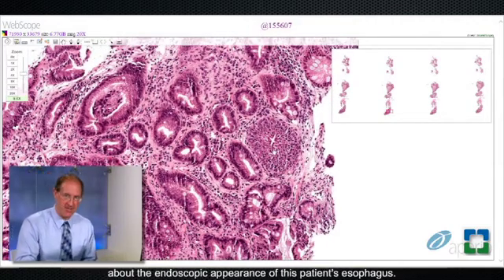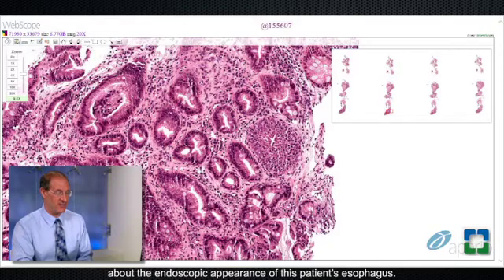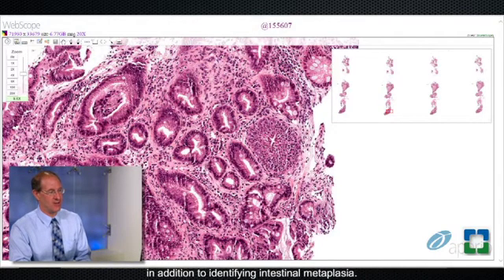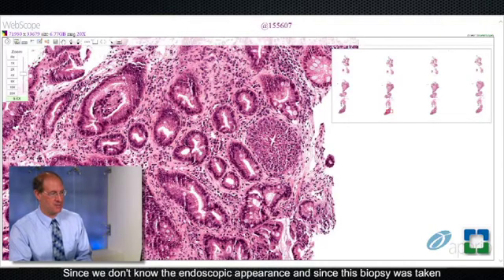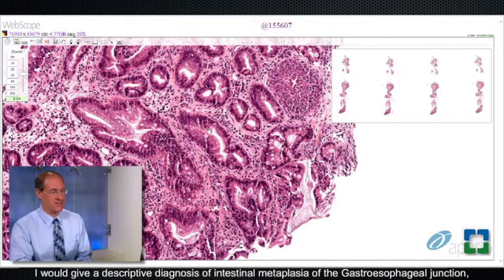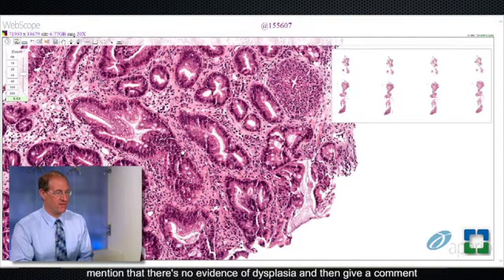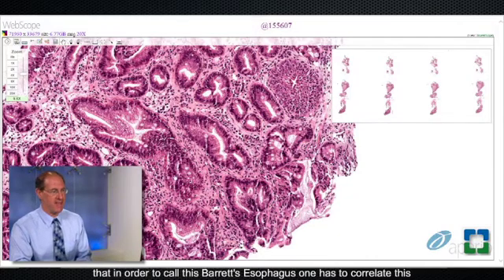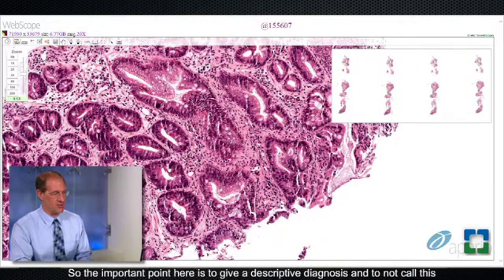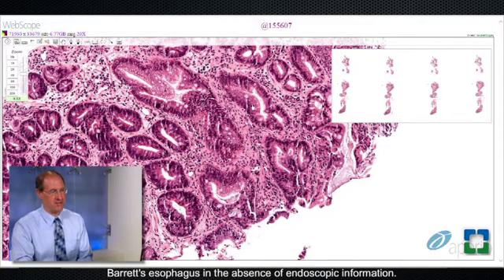The point is we don't know anything about the endoscopic appearance of this patient's esophagus. By definition, according to the American College of Gastroenterology, at least one centimeter of columnar-lined esophagus has to be present in addition to identifying intestinal metaplasia. Since we don't know the endoscopic appearance and since this biopsy was taken from the gastroesophageal junction, I would not call this Barrett's esophagus. I would give a descriptive diagnosis of intestinal metaplasia of the gastroesophageal junction, mention there's no evidence of dysplasia, and give a comment that one has to correlate this with the endoscopic findings.